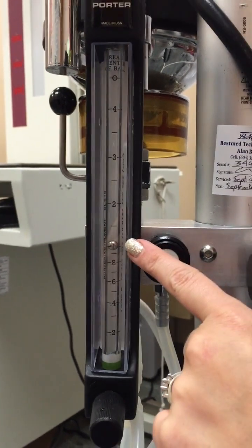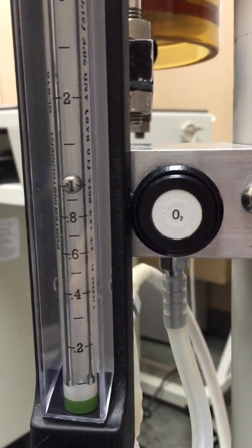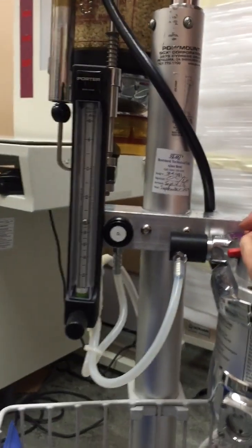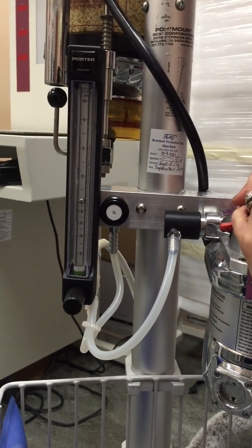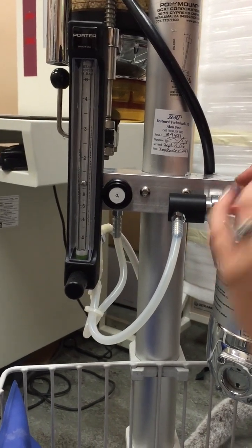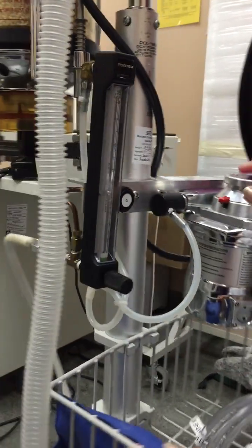If your flow meter has a ball, you will read the flow meter at the center of the ball. Some machines will have an arrowhead. With the arrowhead, which I apologize, I do not have an example of at this time, if you do have a flow meter with that, you'll read the flow meter at the flat part at the top of the arrowhead.